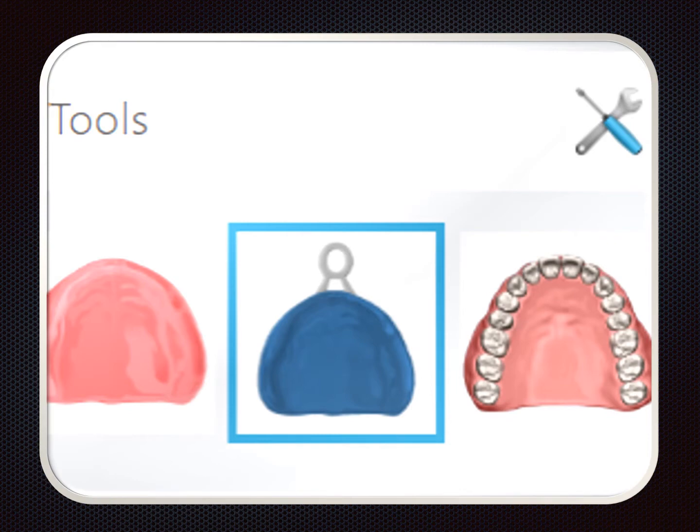Most intraoral scanners have a feature or workflow for dentures. This TRIOS workflow allows the option of scanning the edentulous ridge or scanning a complete denture — very helpful if the patient wants little change, a replication or duplication of what they have. Since we will be making some changes, I chose the middle option: to scan an impression.